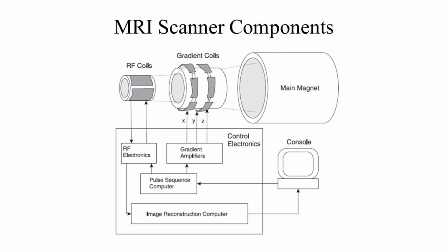And the last important part is the radio frequency coil. This is both what generates the radio frequency pulse that tilts the magnetization vector, and it's also the coil that receives the radio frequency signal and then sends that to the computer to decode it and interpret it for both pixel intensity and spatial information. Now that would just come through as a voltage change. It's this big oscillating wave of voltage, but that's what we're going to do the Fourier transform on, to extract both spatial information and pixel intensity information.